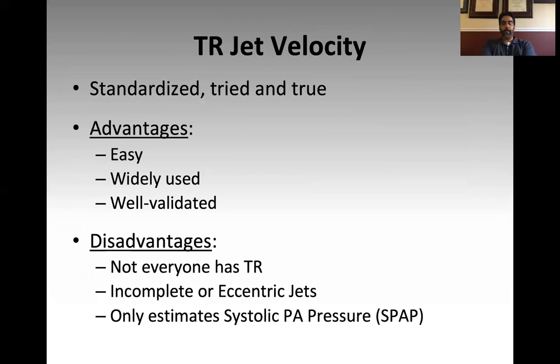So what about the TR jet velocity as far as advantages and disadvantages? This is your tried and true method. This method has been there for a long time. It's been studied, it's been standardized. So it's the go-to method for non-invasively estimating right ventricular pressures.